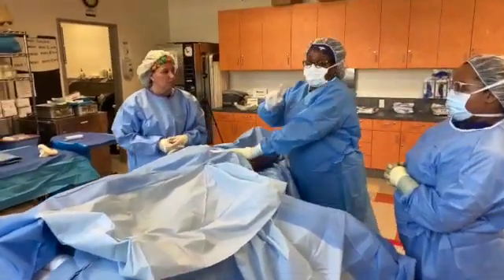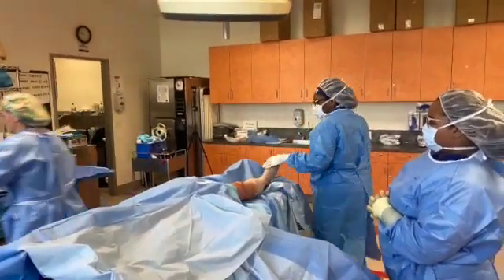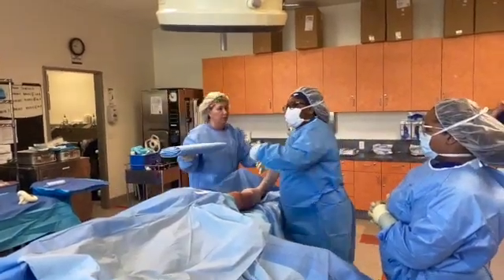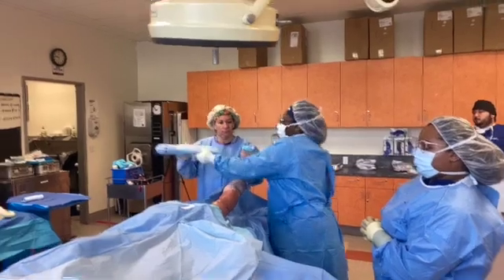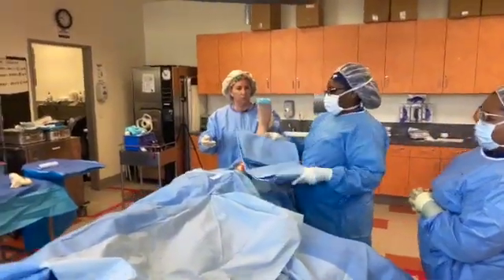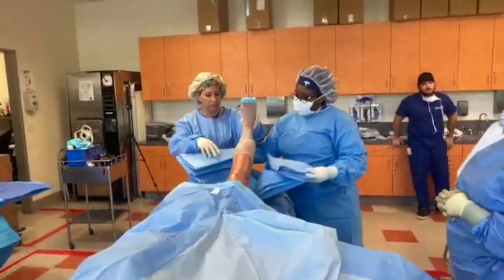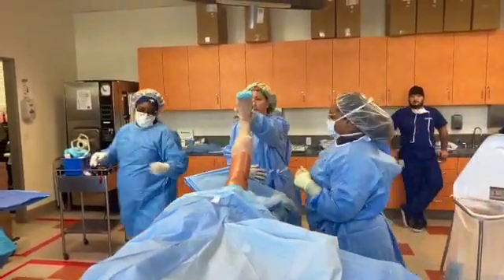All right, stop. Now, since we have this one, let me show you a split sheet. So same thing. The only difference is, did it say down or up? Tails down or up? Tails down. Yeah, so just let it out, tails go up. You're right. So in this instance, okay, Bree, we'll switch. You stay here. I'll hold the leg.